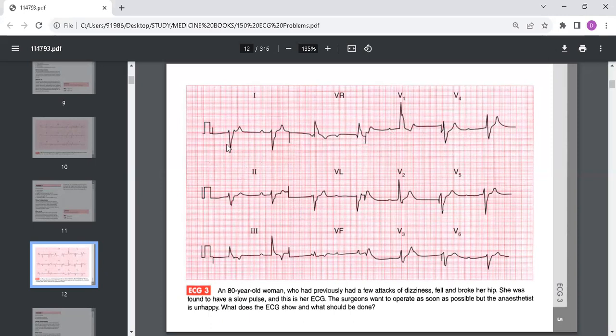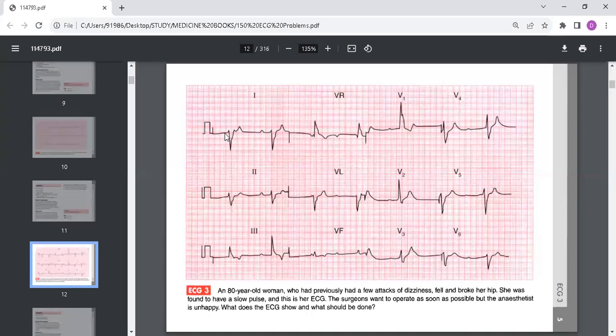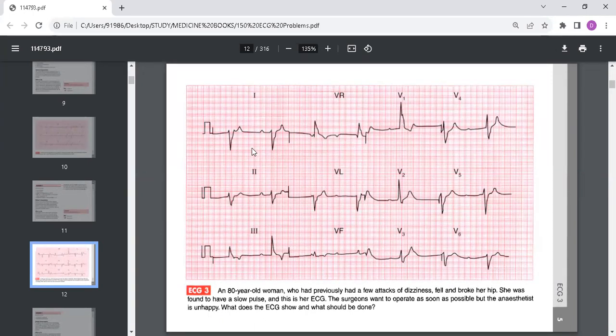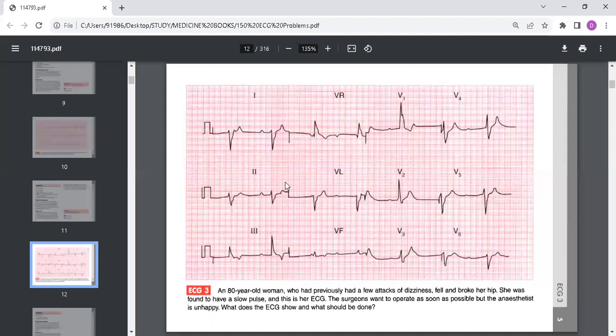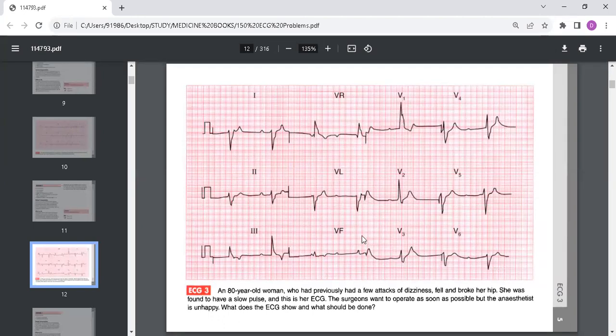This ECG shows the P wave rate being around 130 beats per minute, and there is complete heart block because there's no association between the P waves and the QRS. If you check the ventricular QRS complex rate, it is 23 beats per minute. The ventricular escape rhythm has wide QRS complexes and there are abnormal T waves. No further interpretation of the ECG is possible.